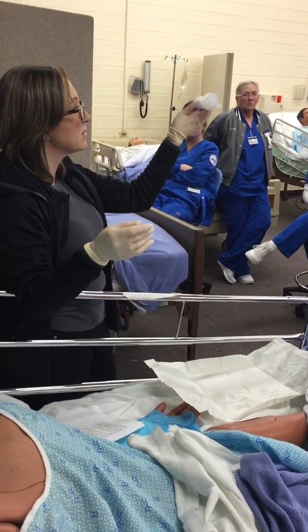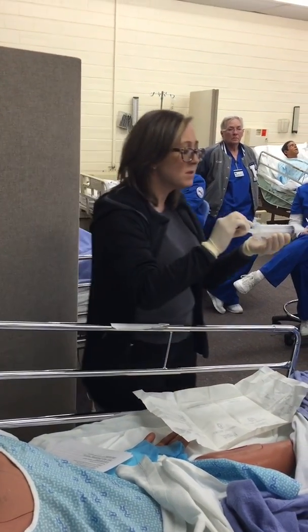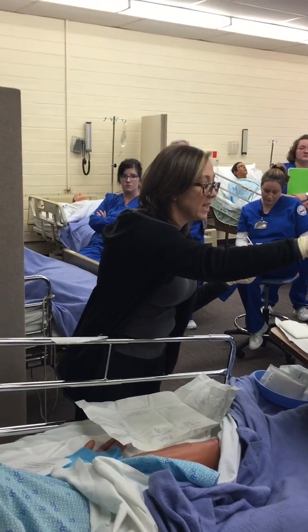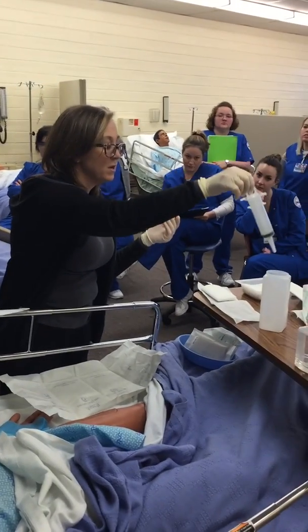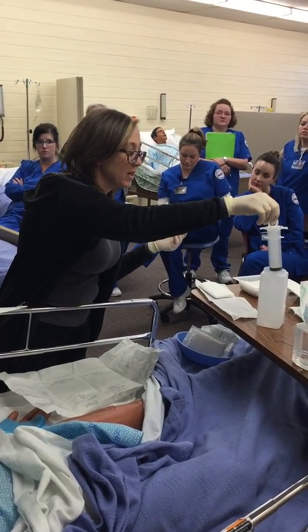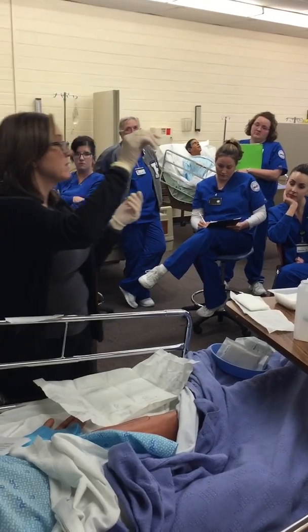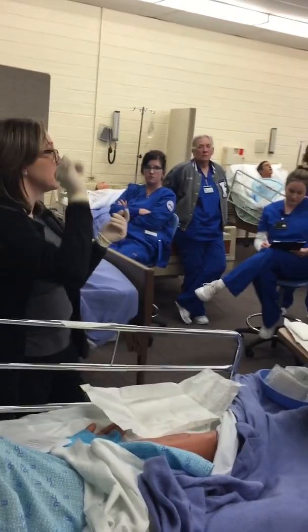So is this hand still sterile? Yes. Okay? So I'm going to take my unsterile hand here. I'm going to put this, and don't hit the outside. That breaks sterile. So when you're putting this in, make sure it goes straight in and straight down, because you might have to pull it back out. You might need it again. So sterile. Okay? This hand's not sterile, is it?